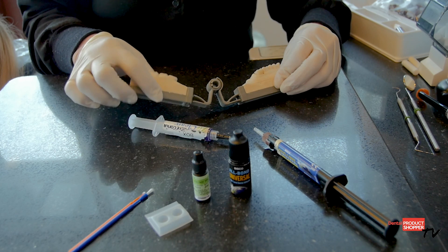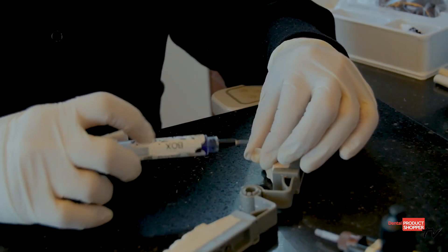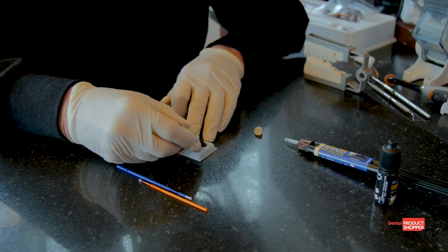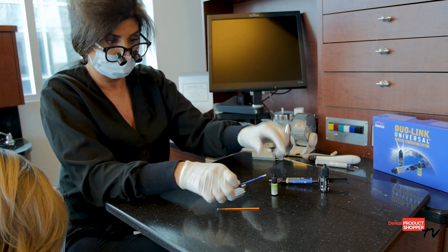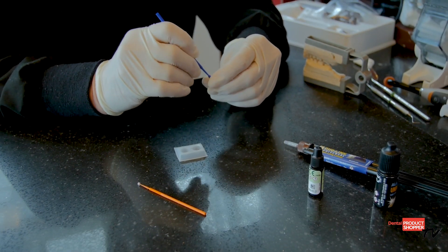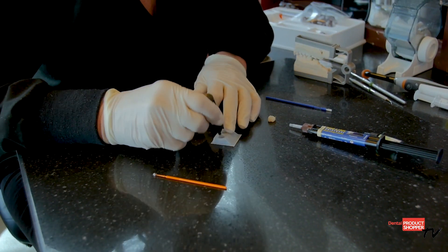Duo-Link Universal is a dual-cured resin cement formulated for cementation of all indirect restorations, with the exception of cementing veneers. It is ideal for all chairside and laboratory fabricated restorations such as crowns, onlays, and inlays. A bonded restoration is a stronger restoration, and due to Duo-Link's high degree of conversion, using Duo-Link ensures a strong, long-lasting restoration.